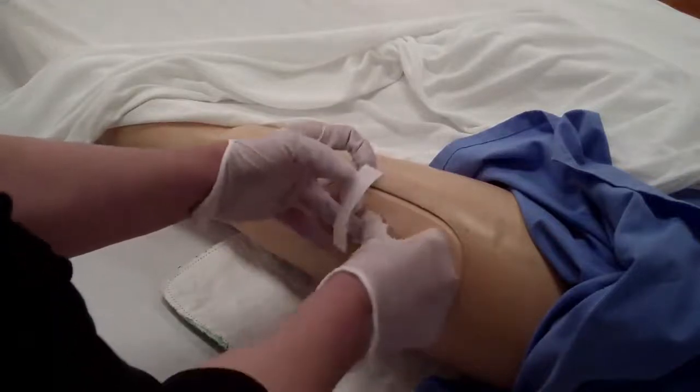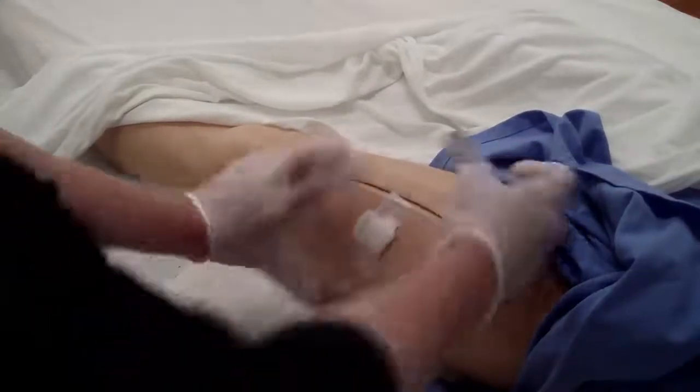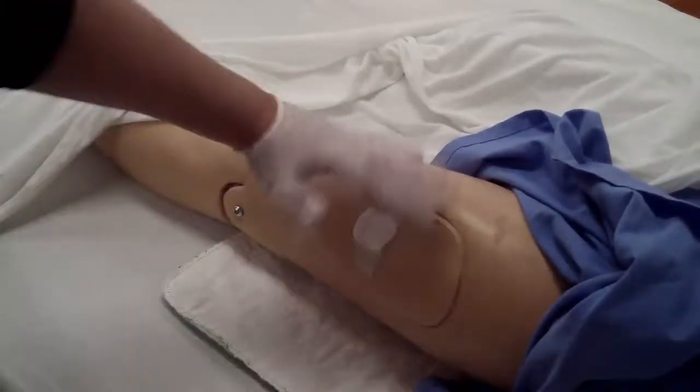Apply gauze, tape, and pressure to the insertion site. Remember to remove this dressing later. Ensure that your client is safe and comfortable, and document as necessary.